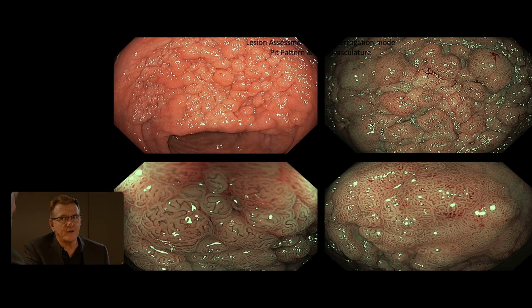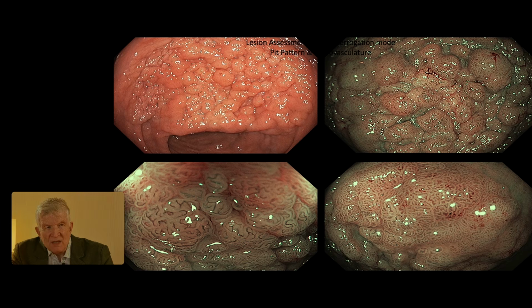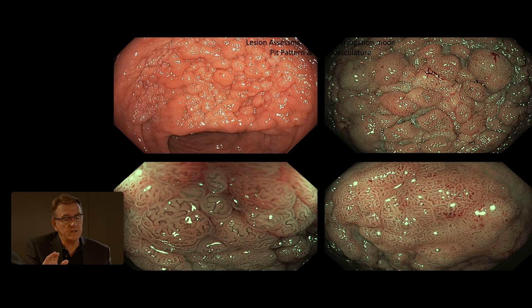You don't need to go nuts, because we've shown that in a flat lesion you can reliably detect submucosal invasion, early submucosal invasion, because it stands out, even from some distance. I'm going to show some examples. I like to use the term lesion homogeneity. The lesion is homogeneous, both in overview and also in focal interrogation.